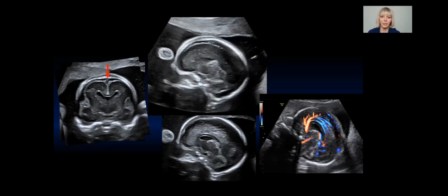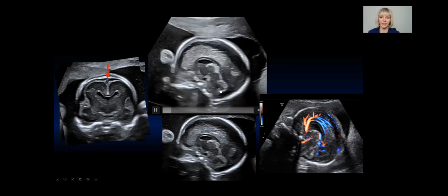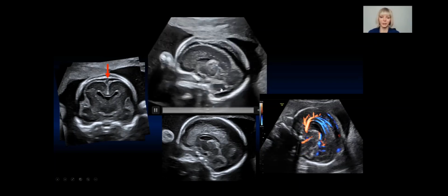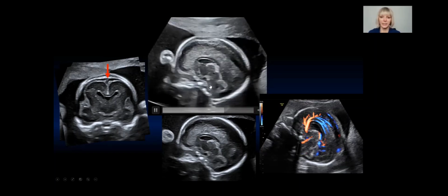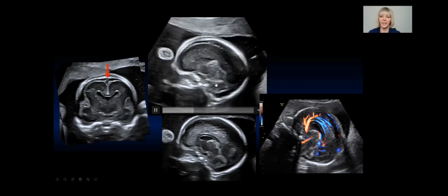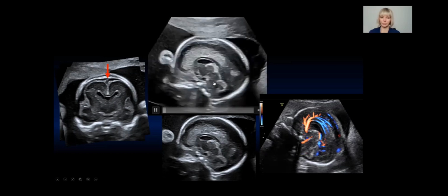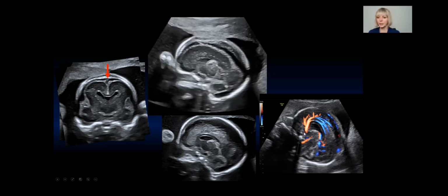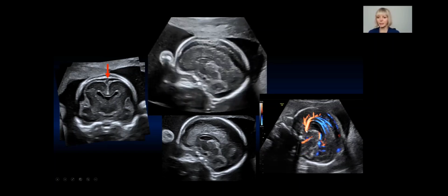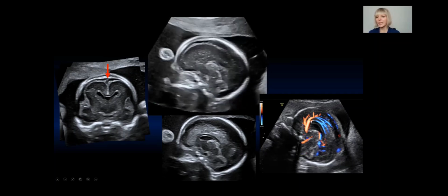You can also see, as a landmark, there is a view of the midline sagittal vermis with its primary fissure. And this looks completely echogenic, which tells you that you are in the vermis and not laterally displaced into the cerebellar hemisphere. If you turn your color Doppler on, you can see the branching of the anterior cerebral artery into the pericallosal and the callosomarginal branches.